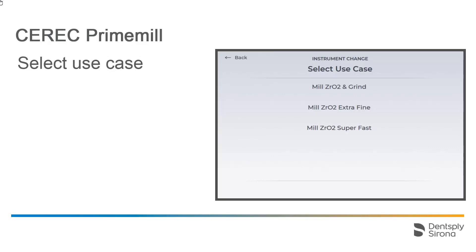Next, you will be prompted to select the use case. In our case, with CEREC Zirconia, three options are available: Mill and Grind, Extra Fine Milling, and Super Fast Milling. The available use cases depend on the material. In our case, we select the last option.